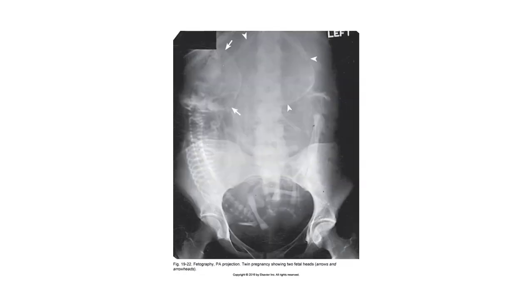Due to radiation protection standards, pregnant patient procedures are typically preferred to be performed under sonography, so discussion is limited to procedural definitions. Fetography is imaging of the fetus in utero and should be avoided until after 18 weeks of gestation. Pelvimetry and fetal cephalometry demonstrate the architecture of the pelvis compared with the size of the fetal head. Placentography shows the walls of the uterus to locate the placenta in cases of placenta previa, a condition where the placenta covers the mother's cervix.